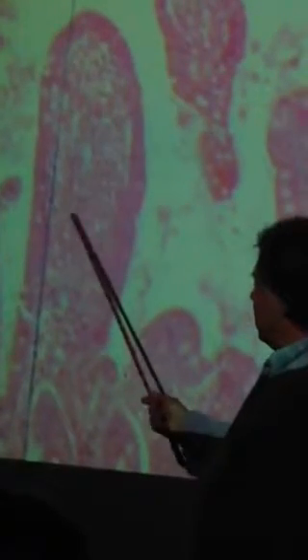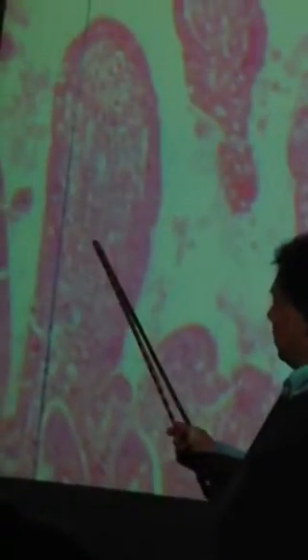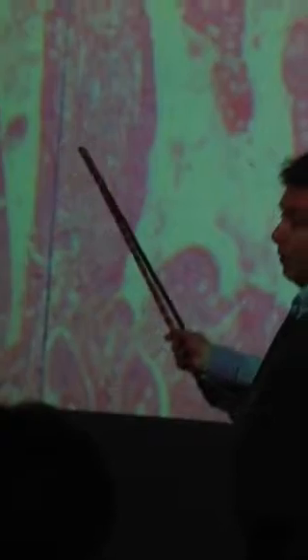And then what do we call the tissue that's in here? What fills this? Lamina propria, right. Now I don't see anything in here, but what would be running down through the center here? Coming down right through the center. Blood vessels. Well, coming down through the center would be a central lacteal, and then the blood vessels, the arterioles and venules and capillaries would be around it. But again, I don't see those on here. But this is just an intestinal villus.